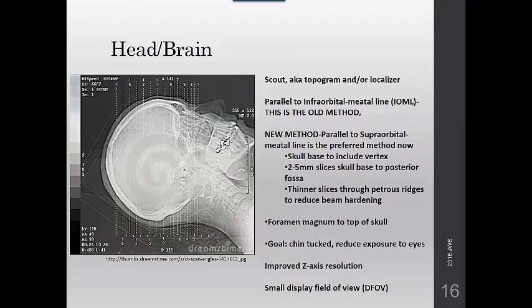But the display field of view is controlled by the technologist by opening and closing the scan lines to include the necessary anatomy while you're setting up the scan parameters on the scout image.